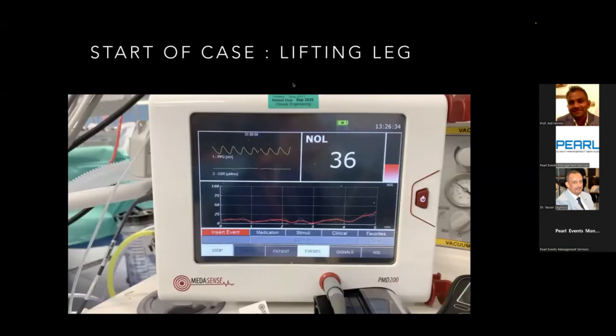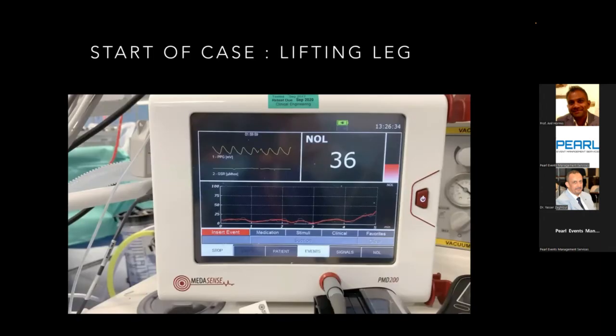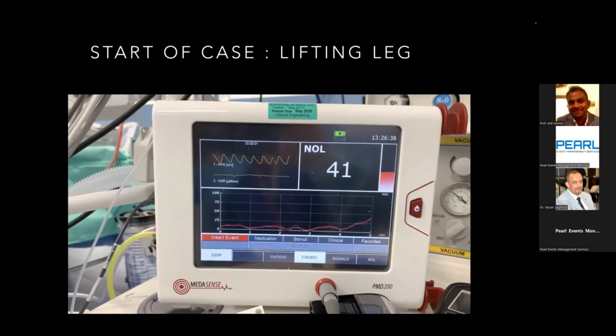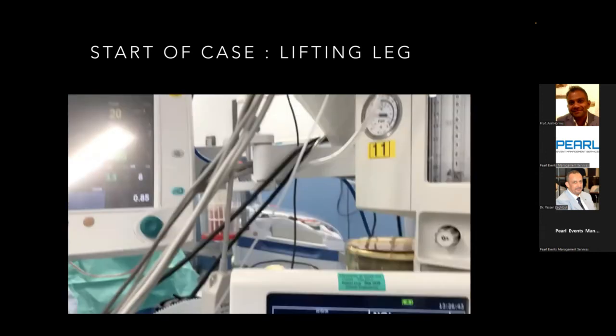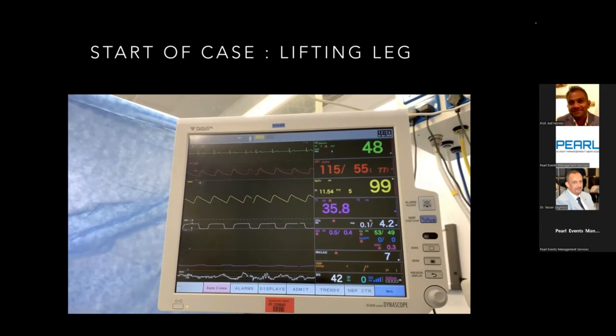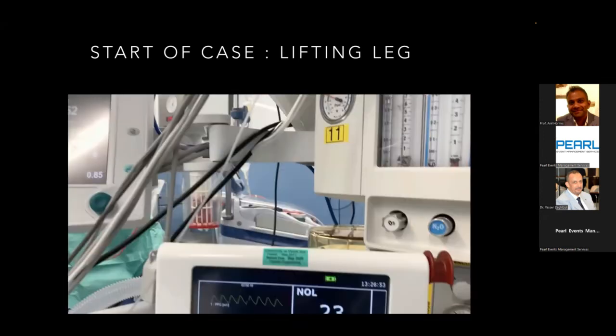So this particular slide, what I want to highlight really is how quickly the NOL can change. The epidural had been placed, there was nothing running through the epidural. At the start of the case, the surgeons are lifting the leg of the patient to do all their prepping. And you can see how the NOL value jumps up very quickly, 36 to 41. And if I pan up to where her observations are, you can see at this stage that there's no change at all in her observations. Heart rate's 48, blood pressure is very well controlled, stats are very well controlled, and she's got an end-tidal MAC of 0.3 at that stage. So the NOL gives a very quick increase when patients are feeling nociception, and at that stage, I gave her a bolus down the epidural.